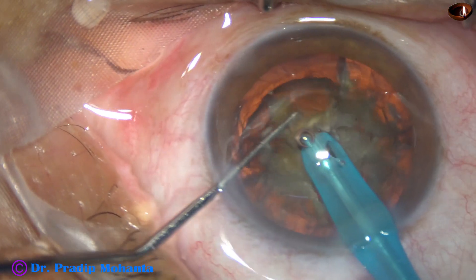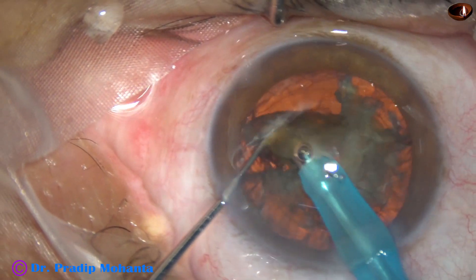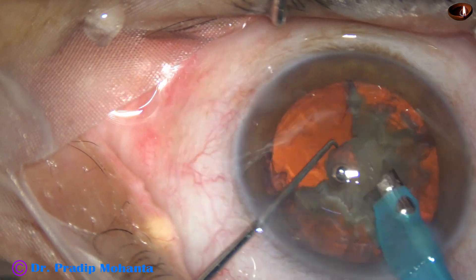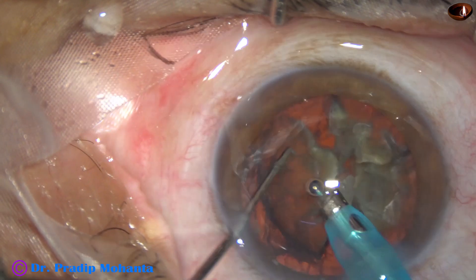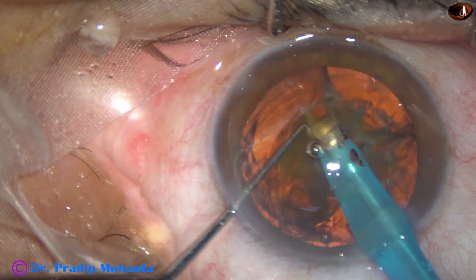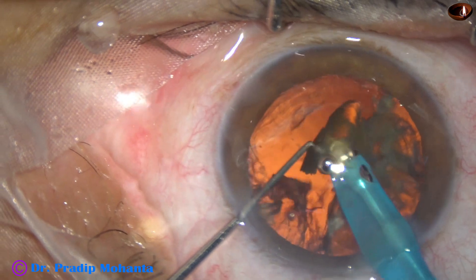Ultrasonic energy being used in this case is 70%. Flow rate is 45 ml per minute and vacuum is 450 millimeters of mercury. The free nuclear fragments are easily picked up, emulsified, and removed.